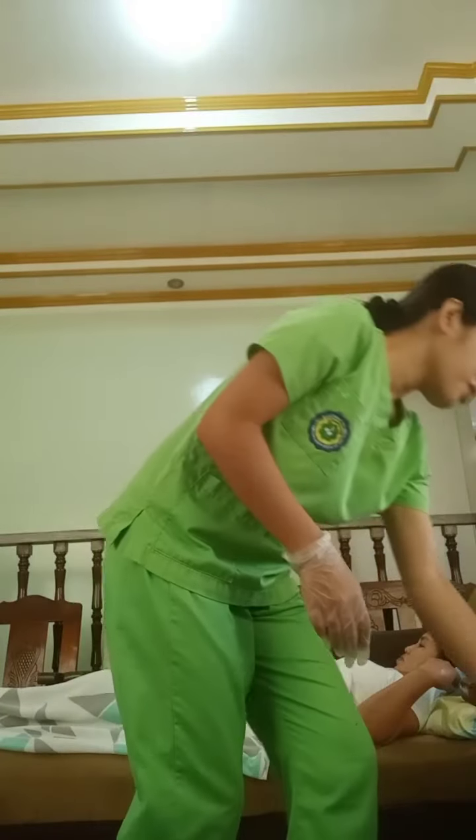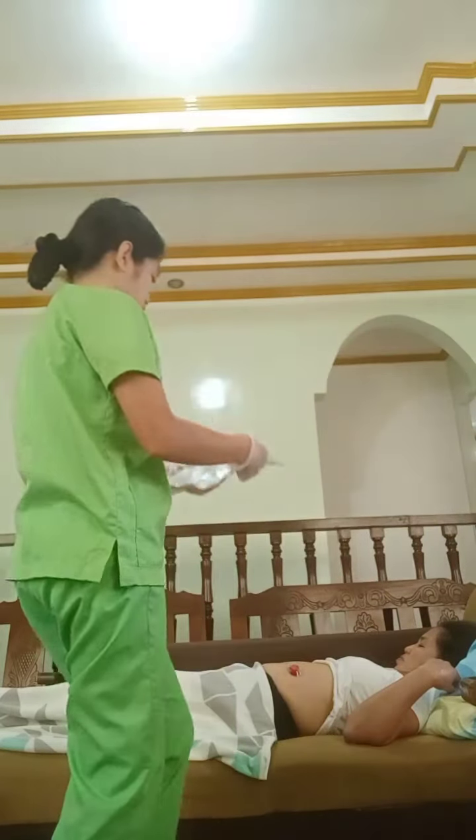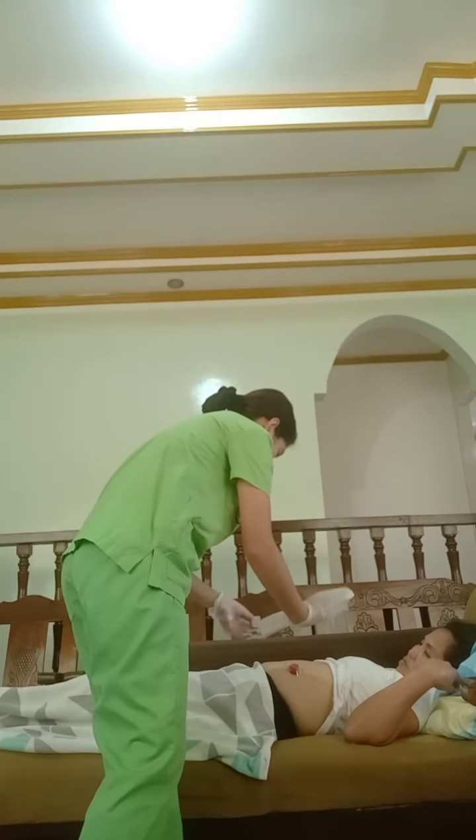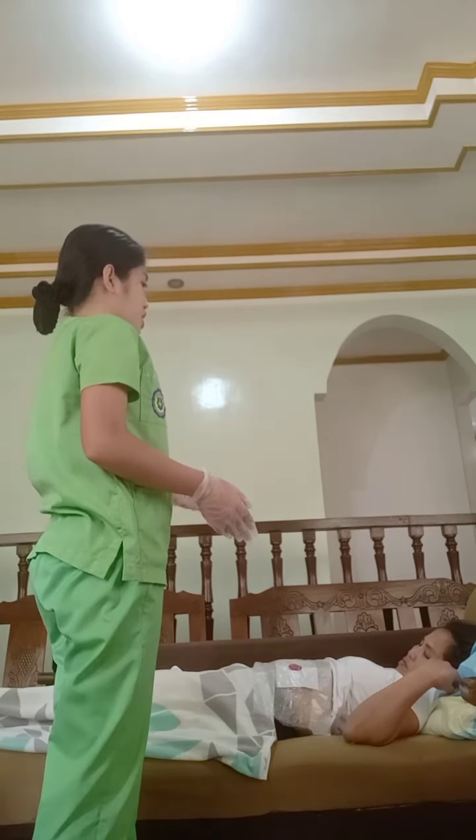And then next, before placing the patch onto the client's skin, we must not forget to allow the area to dry properly.